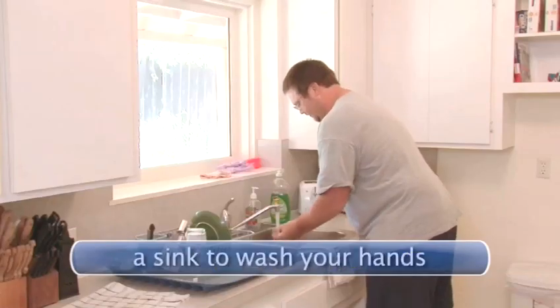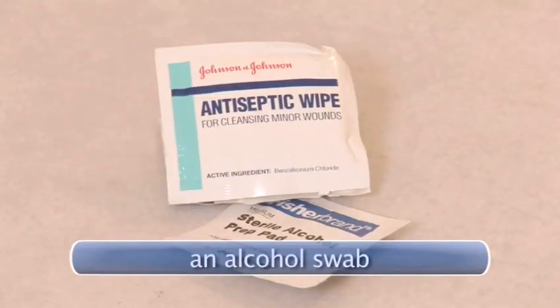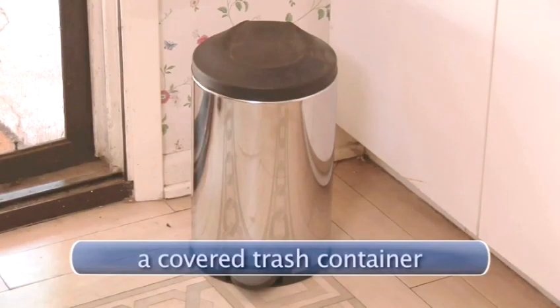You will need a sink to wash and dry your hands, an alcohol swab, a syringe and needle, your bottle of insulin, and a covered trash container.